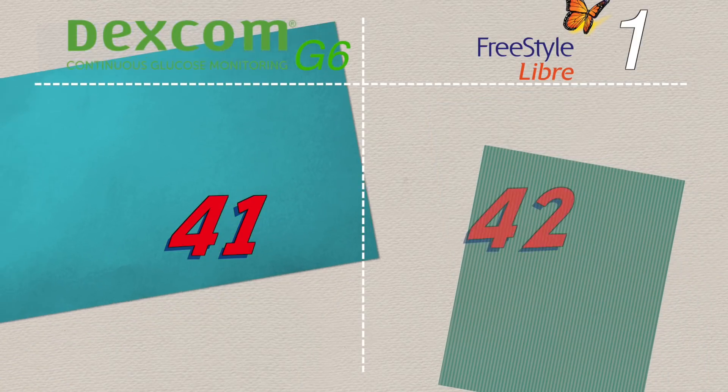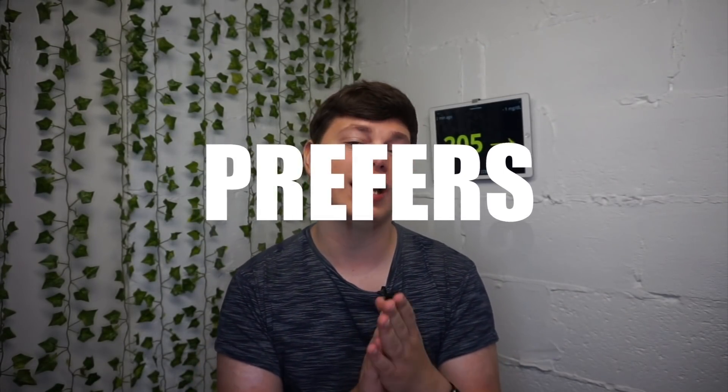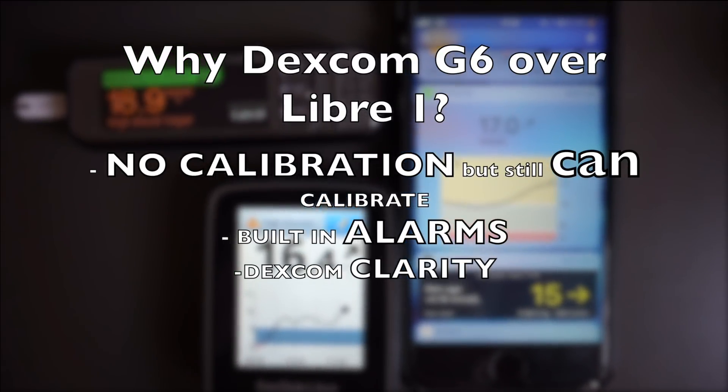Overall scores: Dexcom G6 gets 41 and Freestyle Libre gets 42. This perfectly demonstrates how I feel — they are both really, really good with negatives and positives on each side. Dexcom is more expensive but has built-in alarms; Libre is smaller but doesn't have built-in alarms yet. Personally, I believe Dexcom G6 is a little bit better than Freestyle Libre due to things like optional calibration, built-in alarms, and Clarity.